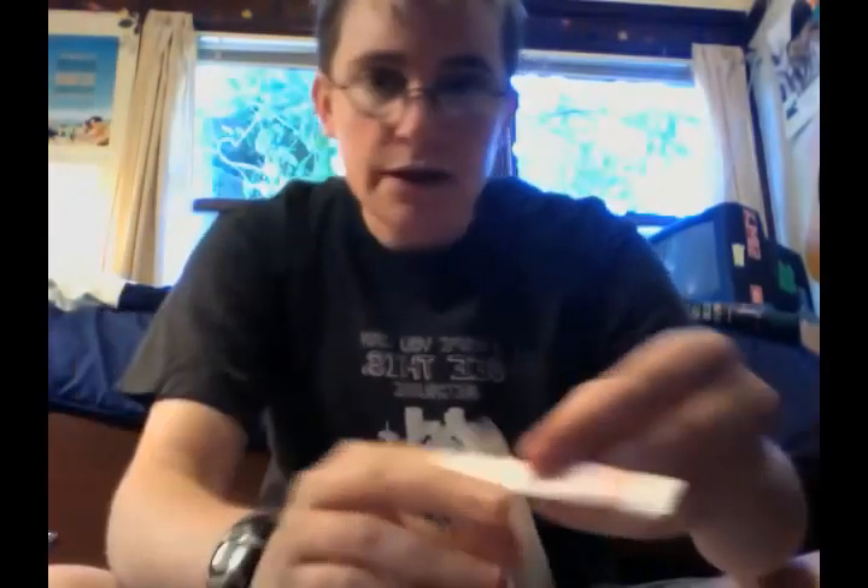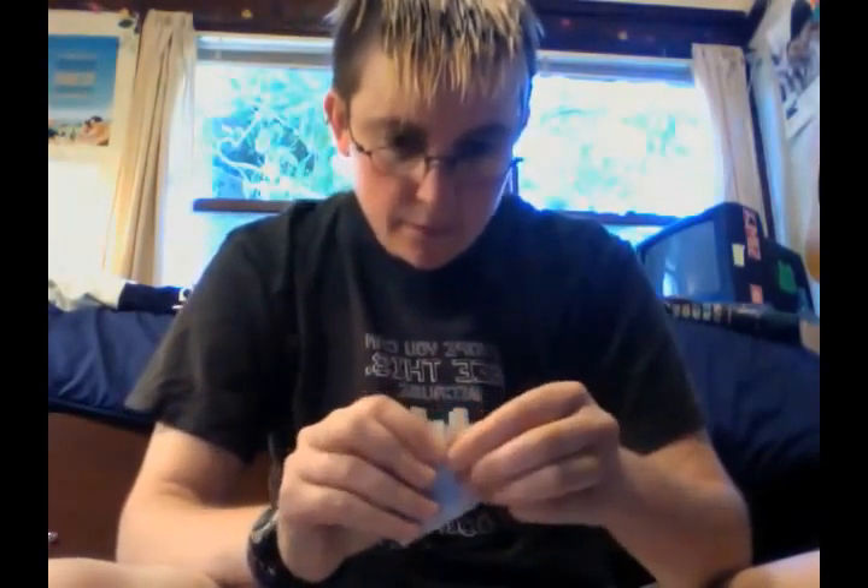Wash hands — check. Vial of medicine, a 22 gauge needle that I'm gonna inject with, an 18 gauge that I'm going to draw it out of the bottle with, a 1ml syringe, 2 alcohol swabs — one for the bottle, one for me — cotton ball, band-aid, and my sharps container. Still very proud of it.